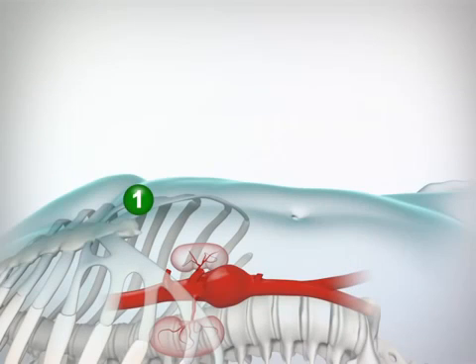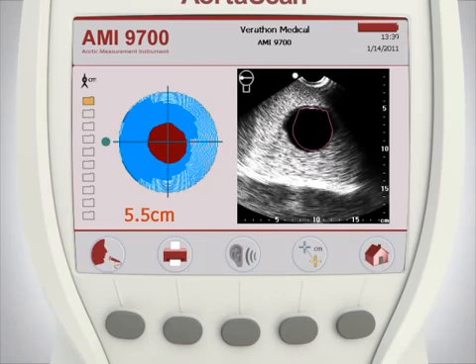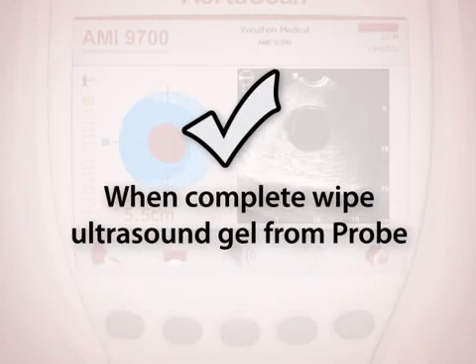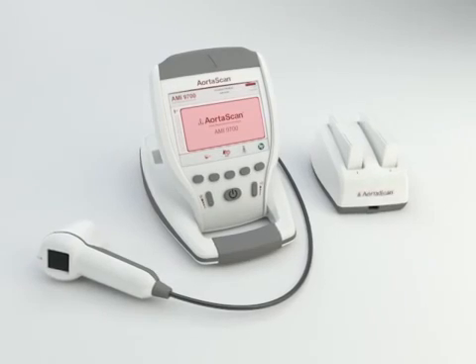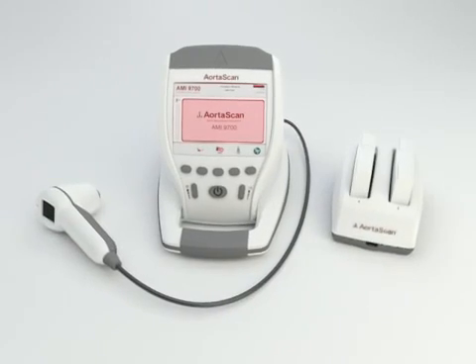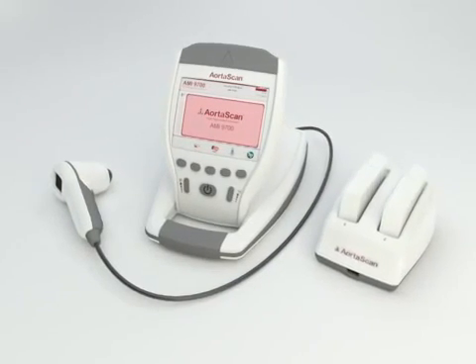Once you have completed the first scan, remember that you must scan the aorta at three more locations between the xiphoid process and the umbilicus to complete the exam. Out of the four aortic diameter measurements taken, the largest diameter should be used by a physician for determining whether the patient may have an aneurysm in the abdominal aorta. Once you have finished all four scans, wipe the ultrasound gel from the probe and turn off the instrument. For users with ScanPoint imaging software, log on to ScanPoint to transfer and save your annotated exams to your Windows computer. The AortaScan AMI-9700 gives you the aortic diameter information you need, quickly, accurately, and non-invasively.